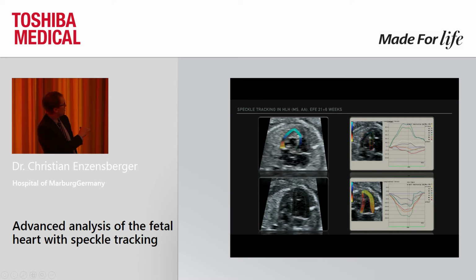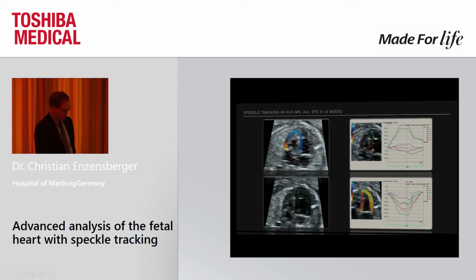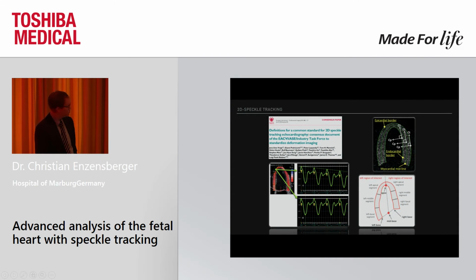You see again here during the systole a stretching of the myocardium, which can be seen in the positive strain values, especially on the apical ones. The right ventricle is a bit narrower than normal, but again slightly lower longitudinal strain values, like we already saw in the cases before.